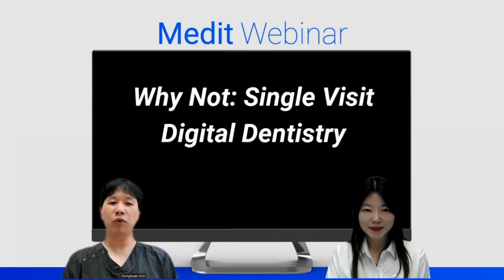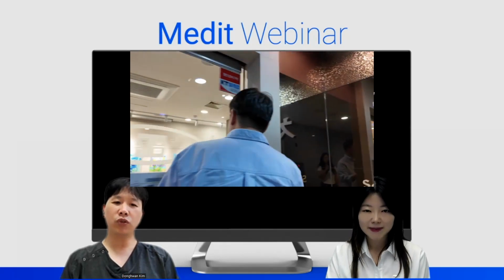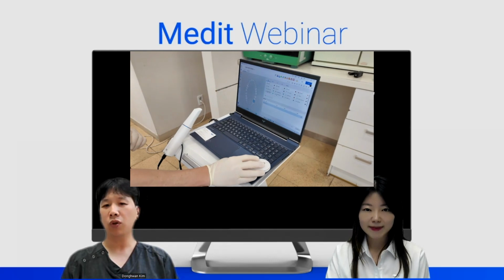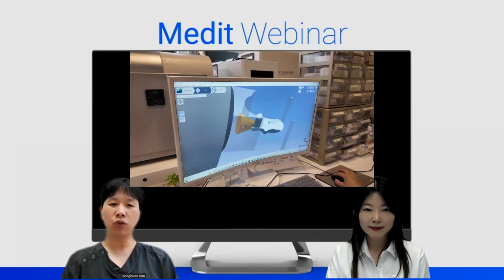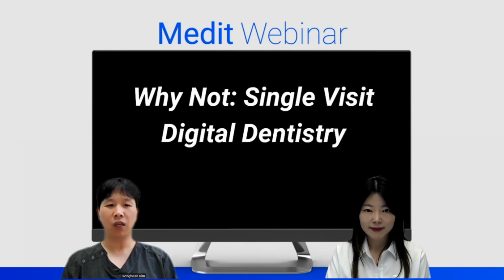Today, I prepared a special webinar, which is like a vlog time. Wow, what's that about? I wanted to share my daily practice with you in real time, so it's going to be more like a vlog than a lecture. I'm going to show you the entire process from the patient's visit to the clinic all the way to the inlay restoration, all completed in a single day visit, and it will all be done digitally.